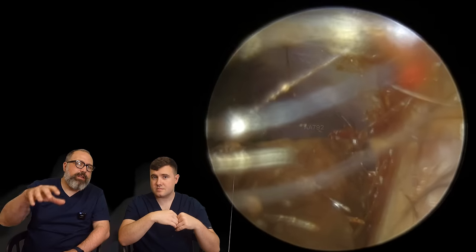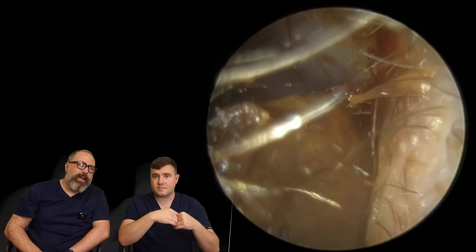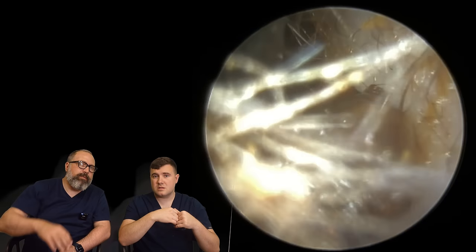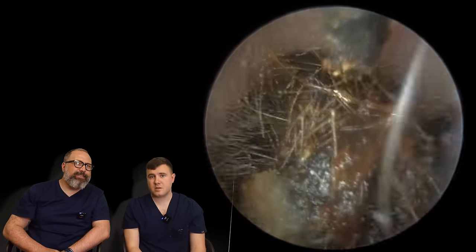You generally tend to have difficulty holding onto these dryer plugs. We'll swap back to the Jobson hone here. Now that we've lifted and peeled that dead skin away from the bottom of this plug, ideally we can get into this little gap behind the plug and should be able to slide this out a lot easier now that we've detached it from the ear canal. A little bit of gentle pressure at the back — you're going to feel a little bit of pressure just as we pull this forward, but that is moving well. Worst case scenario it rolls over, but it's looking like it's going to come away nicely. There's the roll. Oh, that is like a little hedgehog.